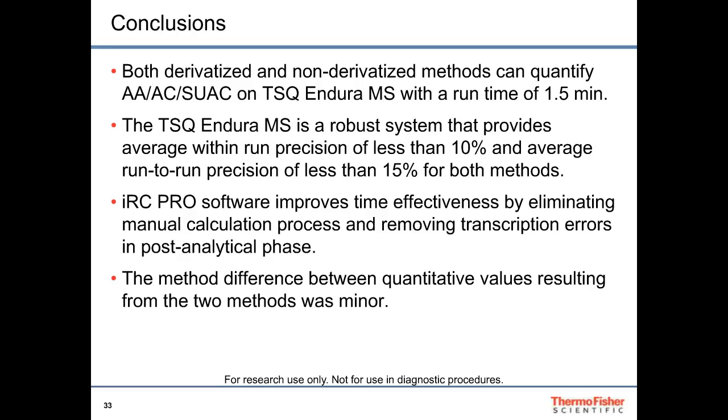However, the non-derivatized method can also achieve pretty good specificity, although it cannot differentiate some analytes with the same mass, such as the C3DC and the C4 hydroxy C4.